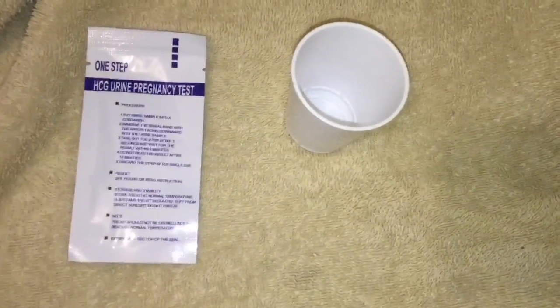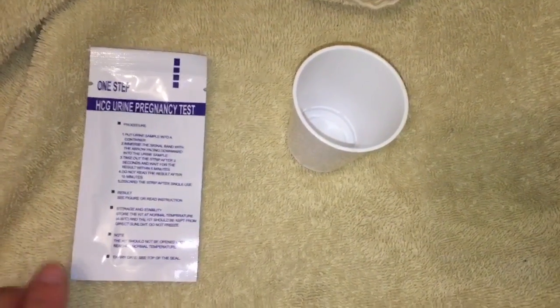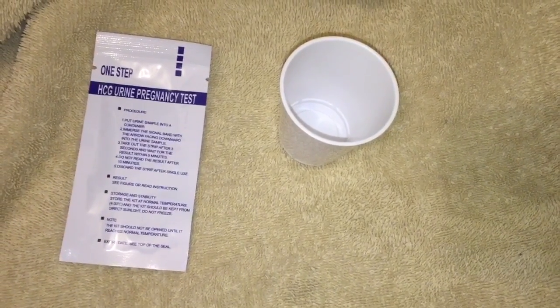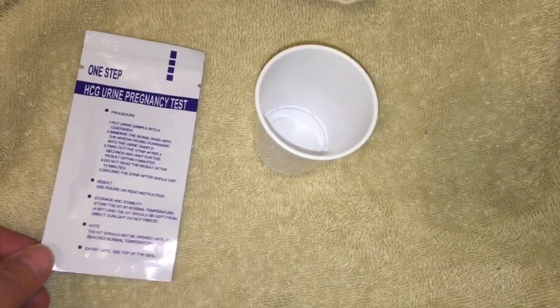I'm going to show how to take a pregnancy test with these HCG urine pregnancy test strips. Not a lot of people seem to be too familiar with these, but the reason I like these is because you can get a whole bunch of them. In my opinion they're pretty accurate — you're going to get varying opinions across the board — but I think they're pretty accurate and you can get a whole lot of them, so if you're testing frequently you're not going to be spending a whole lot of money.